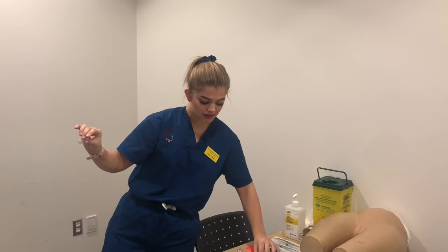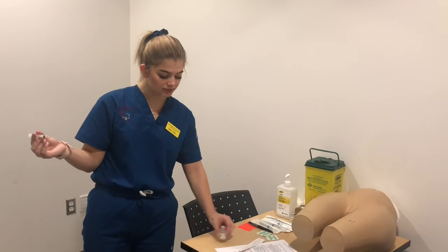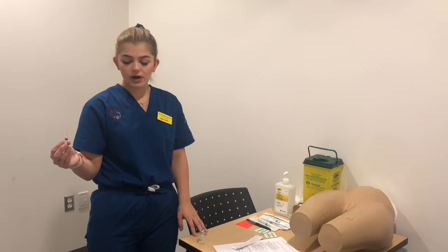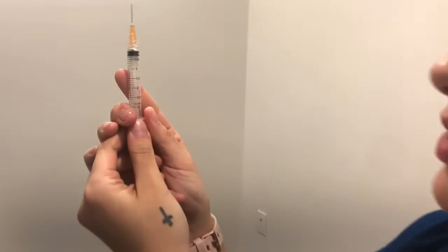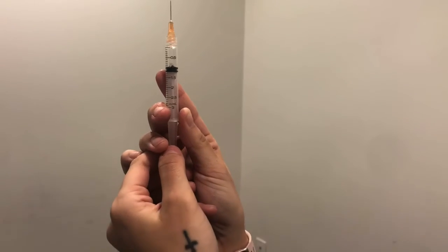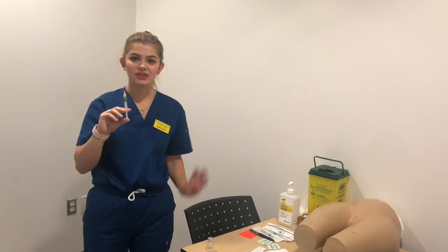I'm just going to stick this cover on the table so I can recap it after. I'm going to make sure my vial is sitting on a flat surface, and before I inject the needle into the vial, I just want to make sure that I draw up the correct amount of air so there's negative air pressure in the syringe. So I'm going to draw it up to 1 milliliter. Okay, so now that I have the air drawn up into the syringe, I'm going to inject it into the vial.